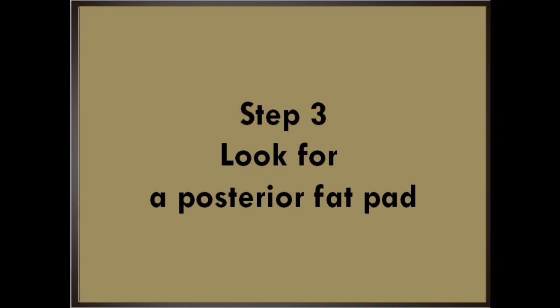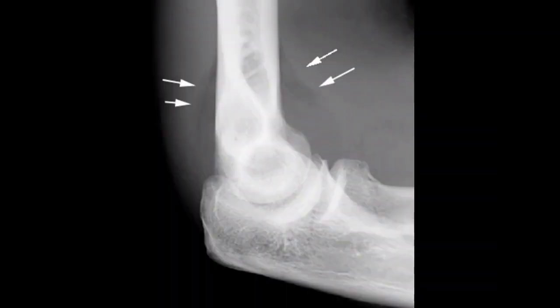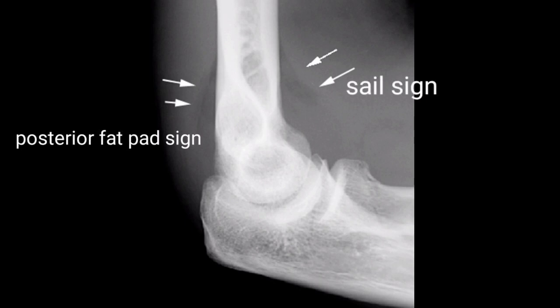Step 3 is to look for a posterior fat pad. Radiographic visualization of a posterior fat pad is never normal and always signifies fluid in the intra-articular space. Again, in the setting of trauma, this strongly indicates a fracture of an articular surface and indicates a fracture in 75% of cases. Here is a radiograph with both sail sign and posterior fat pad sign.